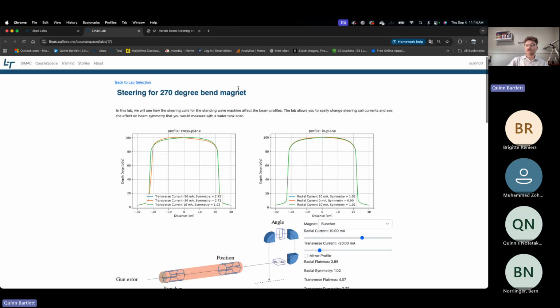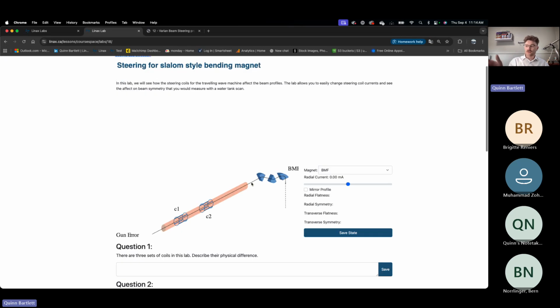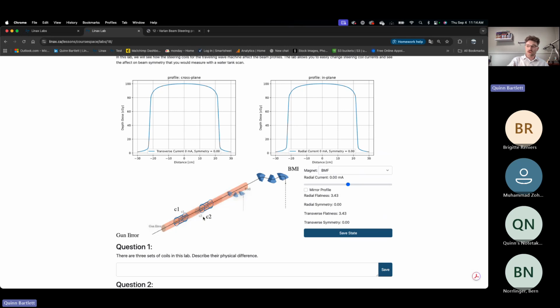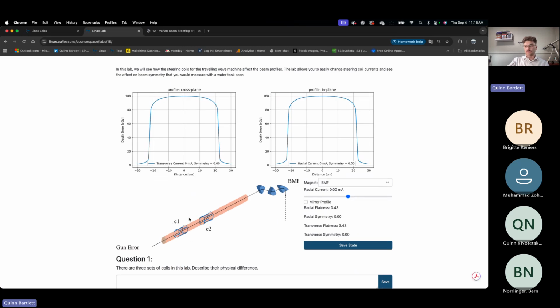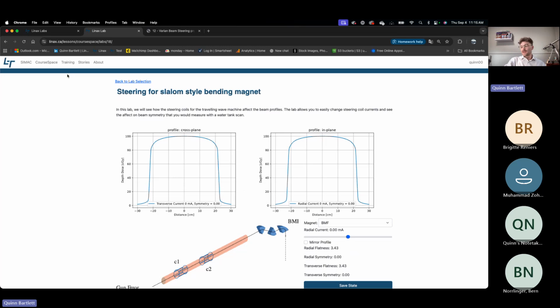So we have our labs, and of course we have the mirrored lab on the slalom section, or your Elekta style Linac, and of course we use the same coil names. So in our Varian, they go with more formal names of transverse position coil and whatnot, where in the Elekta they use C1, C2, and what is it, T1 and T2, and so we have that reflected as well, or R1 and R2. So yeah, that's the other we have.